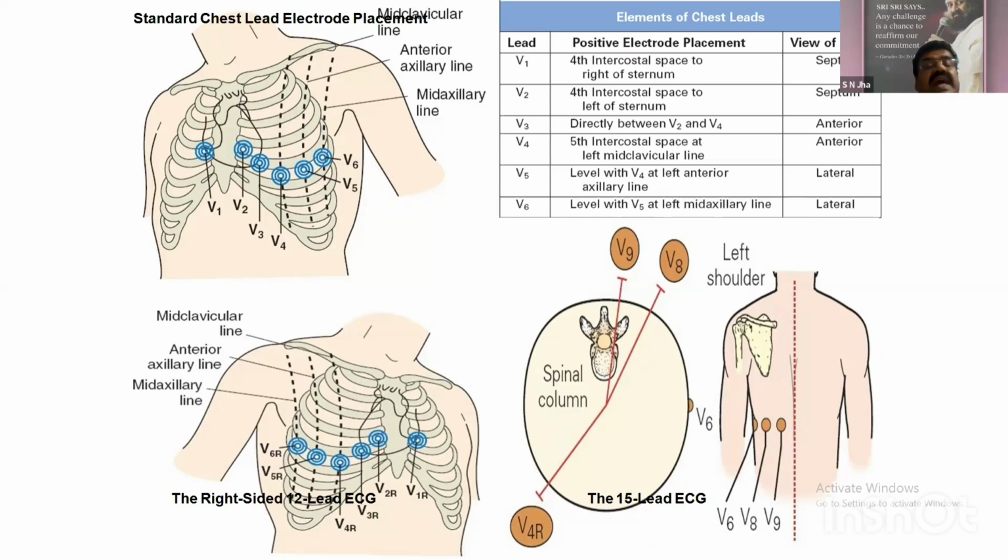You can see the clavicle and the mid clavicular line, and in case of a male, we say just below the left nipple.